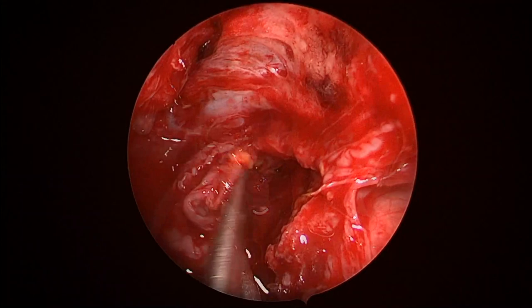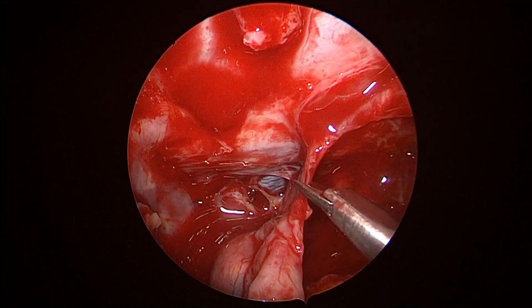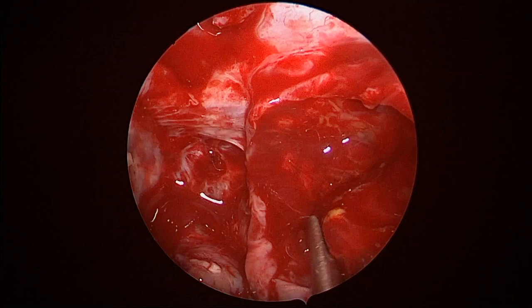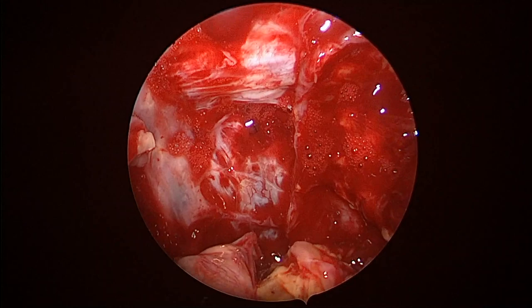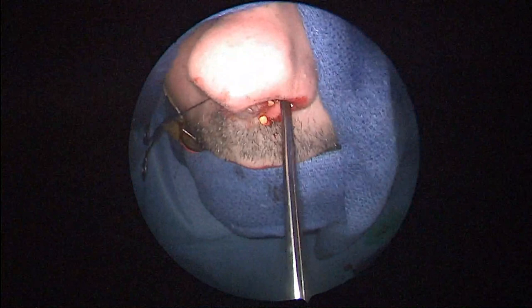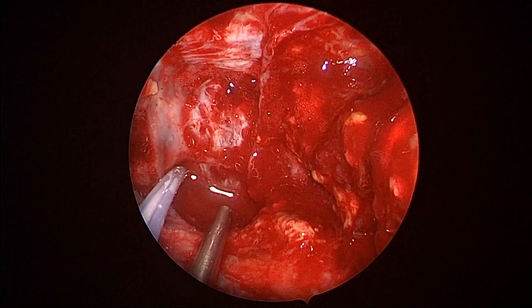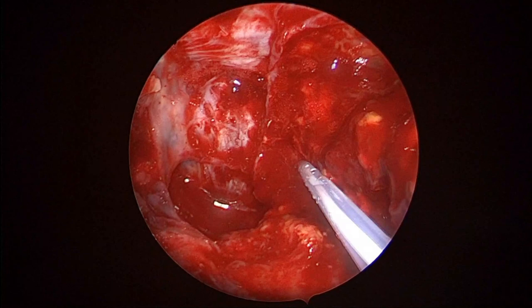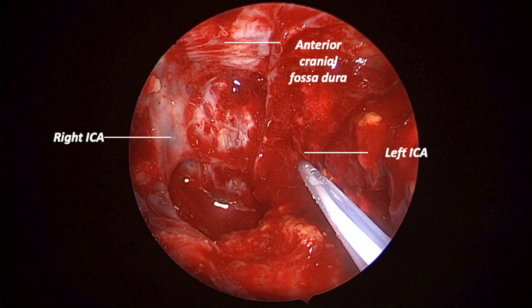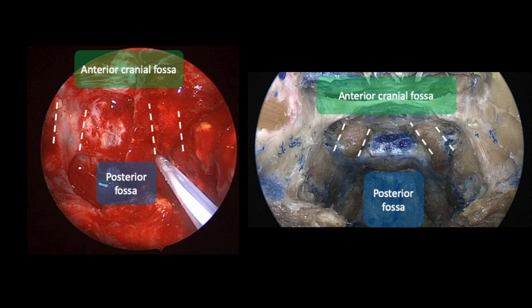As the bone was completely eroded, we were able to dissect and remove the tumor away from the dura of the anterior skull base. Dissecting more posteriorly, we identified that on the left side the tumor was highly invasive to adjacent structures. We removed the entire component of the tumor located on the sphenoid as well as the clival area, exposing the carotid on both sides. The carotid was eroded and dehiscent on the right and left portions of the paraclival region. Both carotid arteries were observed, correlated with anatomical landmarks visible in the imaging.